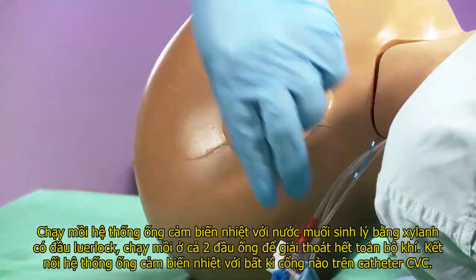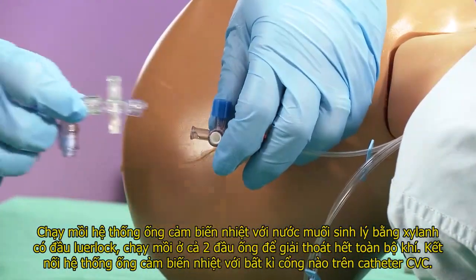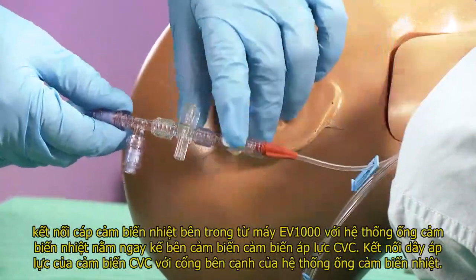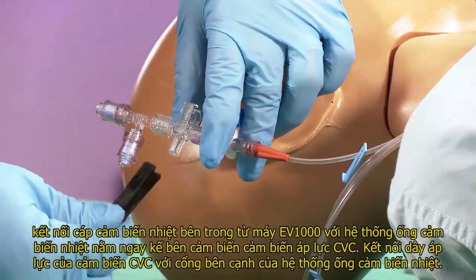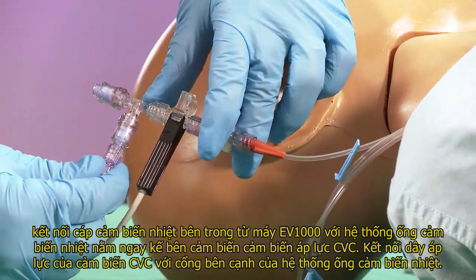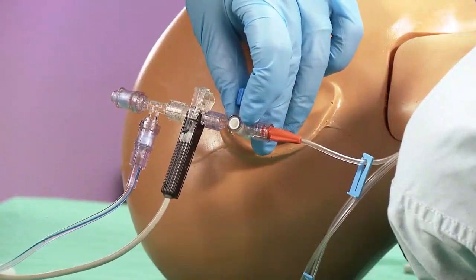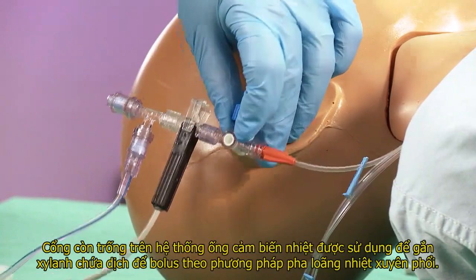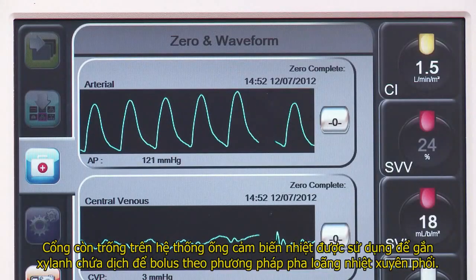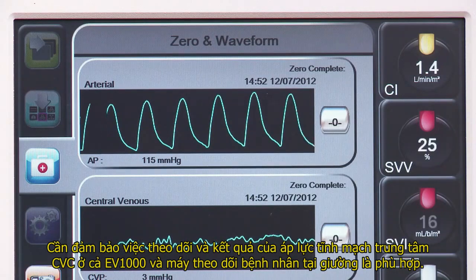Connect the thermistor manifold to any port of the CVC catheter. Connect the inline thermistor cable from the EV1000 clinical platform to the inline thermistor manifold connection next to the CVC pressure transducer port. Connect the CVC transducer pressure tubing to the side port on the thermistor manifold. The free port on the thermistor manifold is used for the syringe containing the Tptd bolus. Confirm that the appropriate CVC pressure tracing and reading is on the EV1000 clinical platform and the bedside monitor.